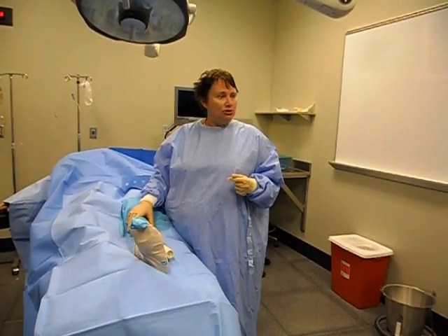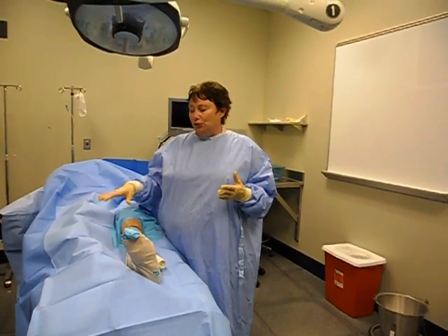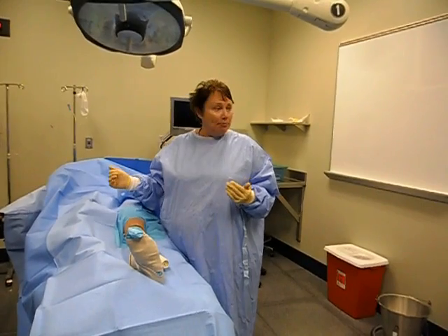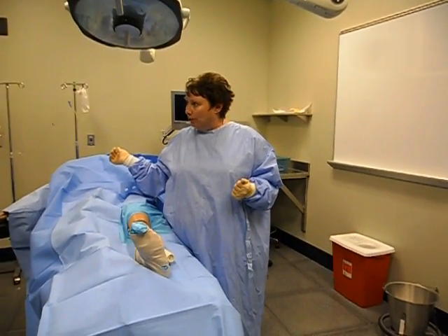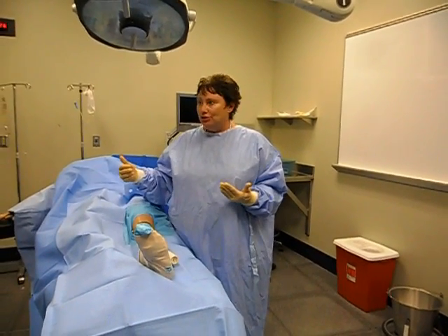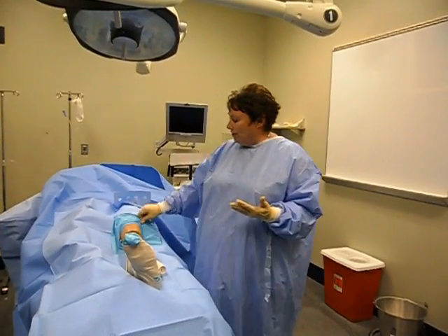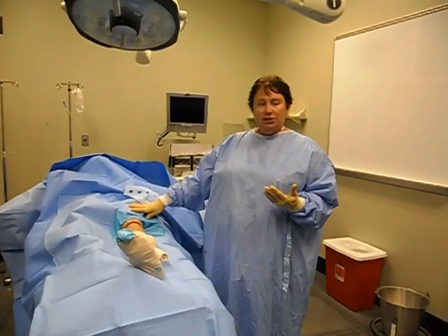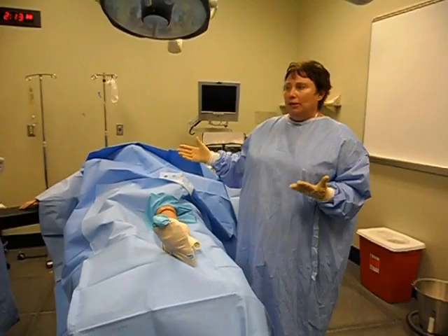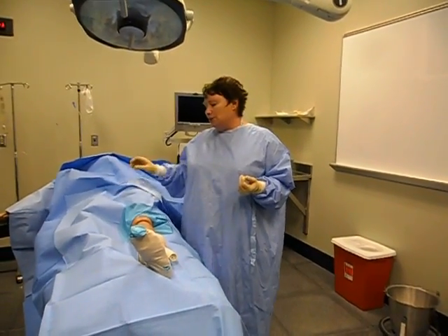Do you have any questions with this? For practice purposes, if you want to use this drape and refold it, have at it. But the green laparotomy drape — the cloth one with a much bigger hole — is the same concept, so you might want to fold that up like you did for abdominal draping and use that. This one is much more difficult to try to fold up. And here's where you could put your light cord through, any cautery, your shaver cord, whatever — some surgeons like to use this, some don't.